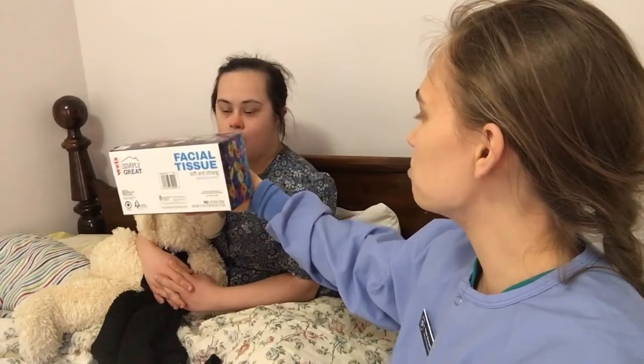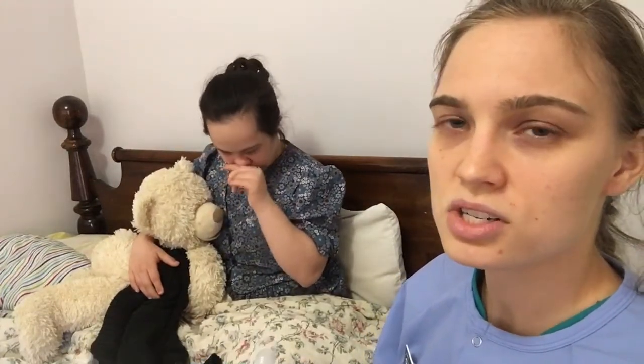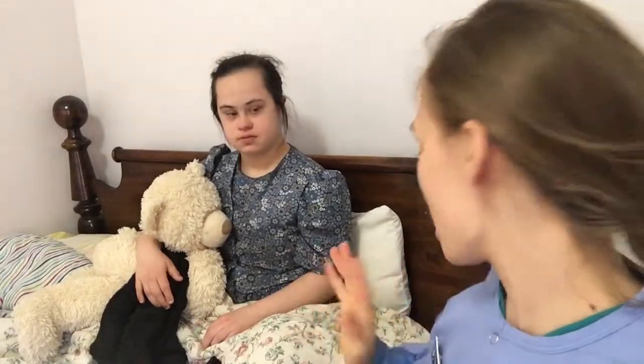Okay, now you can breathe out. Now you can cough. That's how you use the incentive spirometer — it's typically used several times an hour to encourage lung expansion. After all this, I will wash my hands, make sure that my patient is comfortable, make sure she has her call bell within reach, make sure the bed is lowered to the floor, and I will be back to check on her. She can call me whenever she needs me. That's the end of my oxygen video.